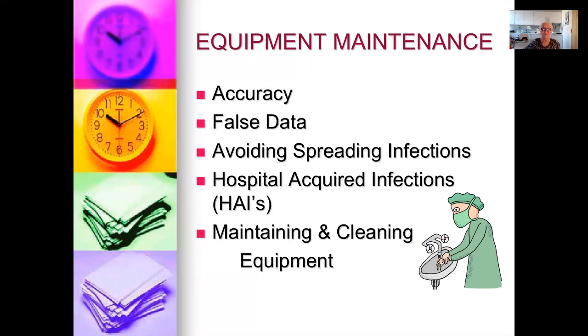And this may be why the wipes are better. There's more area and you can actually prevent people from getting sick by cross-contamination. For infection control purposes, we have discussed cleaning vitals equipment, disinfecting the blood pressure cuff, using gloves, spray disinfectant on a clean rag, then wipe down the blood pressure cuff. This should be done between patients. Take off gloves and wash hands.